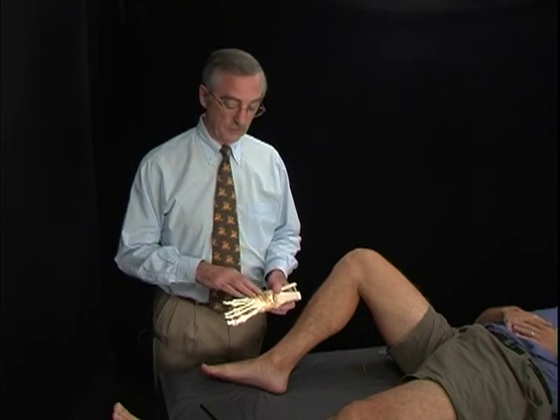We'll now be demonstrating the injections of the foot and ankle. For many people, the foot and ankle are rather confusing because of the complexity of the bones and the ligamentous structures. However, if we divide the ankle into the medial, anterior, and lateral portions, it can simplify the procedure.